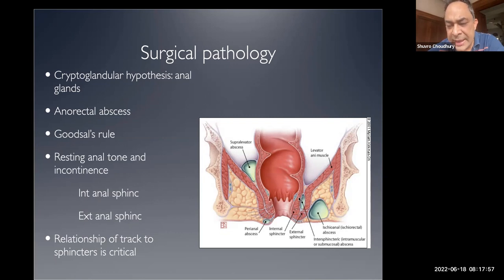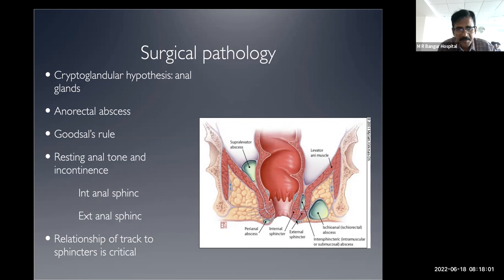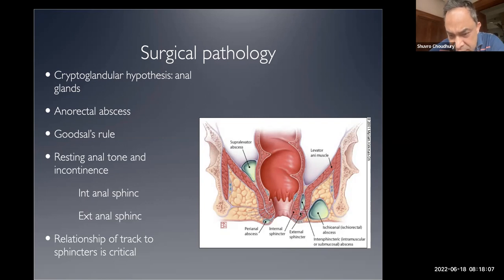So these are all important facts that, as a radiologist, I ought to give you: not only the anatomy of the primary tract, not only the diameter of the primary tract, but also how much external sphincter is below the point where the tract enters the intersphincteric plane, internal sphincter and the dentate line. So all of these are important. And the reason is this particular picture. So it's no different to MRI.